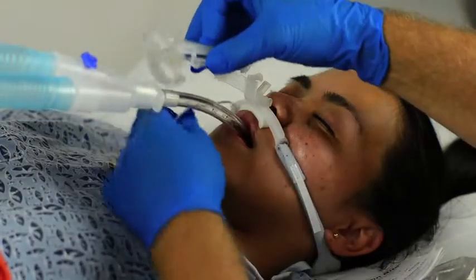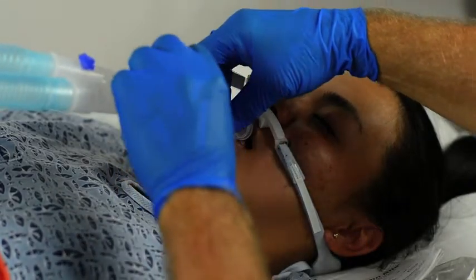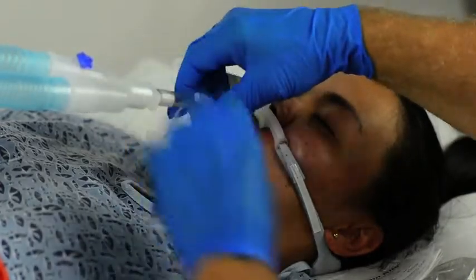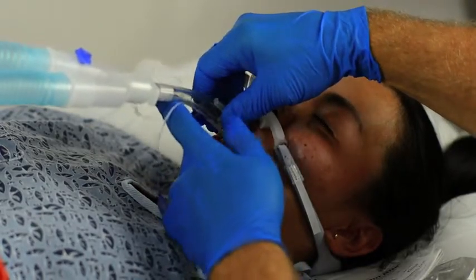Try to close the Auto Light around the ET tube until the latch starts at the block position. Make sure the pilot balloon line is inside the Auto Light so that the tube does not change position. Slide the Auto Light into the patient's mouth until the body of the device comes to rest between the patient's teeth.